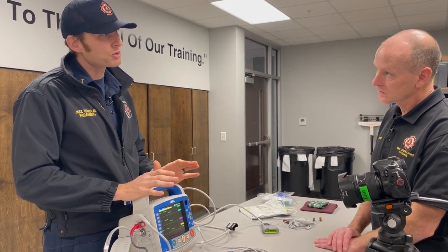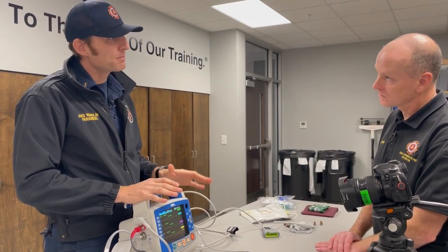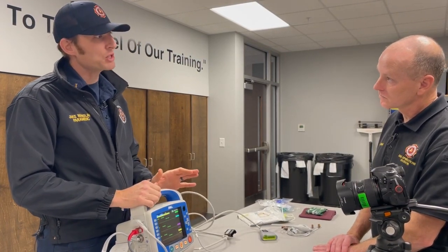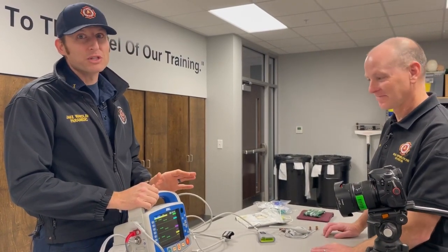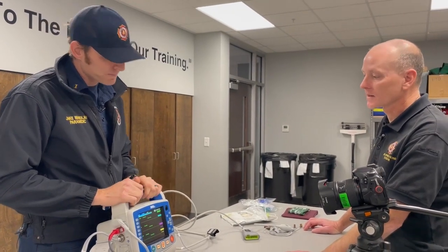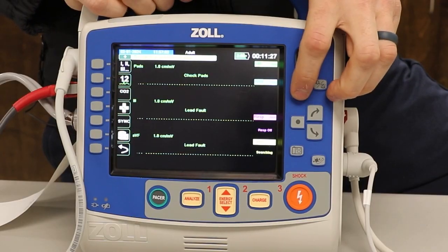You can manipulate those alarm settings. We'll talk about that later, but that button gives you about a minute's silence. I will say this, if it alarms, please look. It's alarming for a reason. Don't get in the habit of just hitting the button and just ignoring it. Look at why it's alarming. Gotcha.